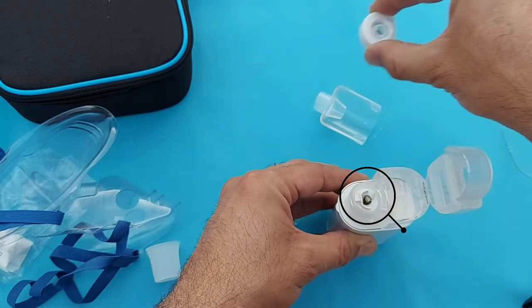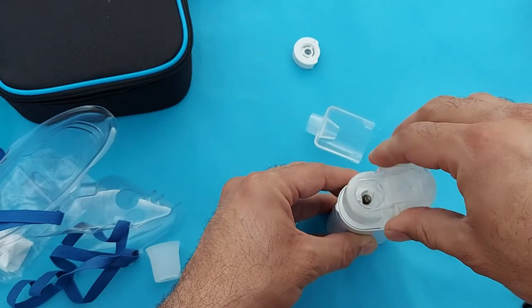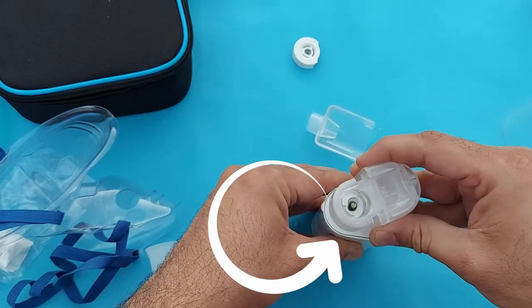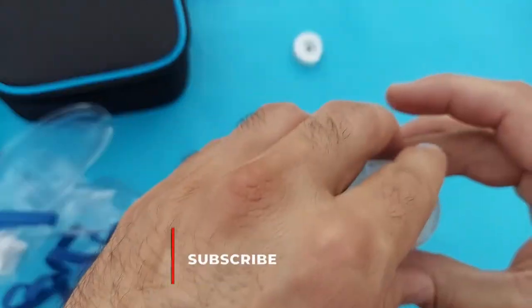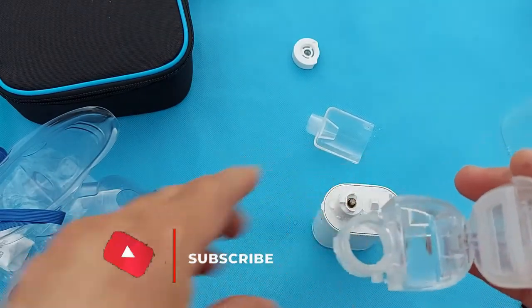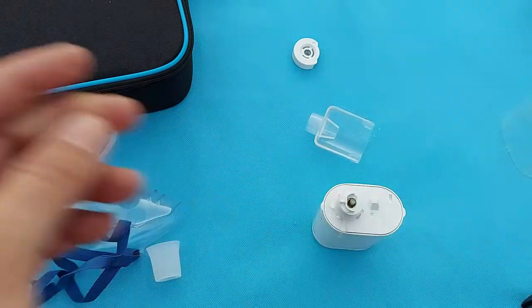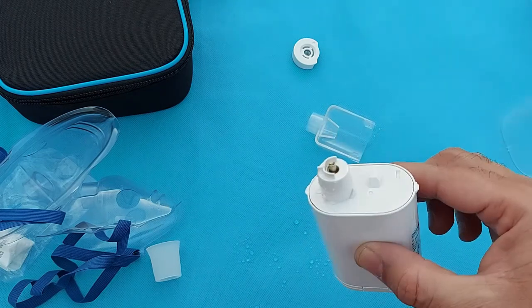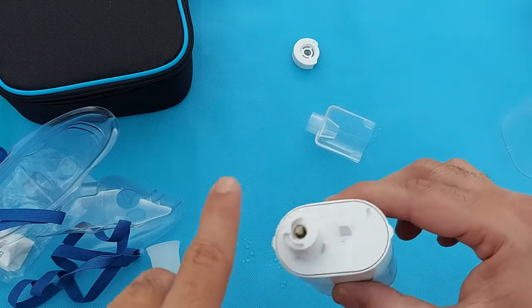By rotating the medication container anti-clockwise you can remove this part from the device. Remove the remaining medication. You can wash the container with water. One important thing: if there is medication or normal saline on the device itself, do not wash it with water — just clean it with a tissue or wipe cloth.